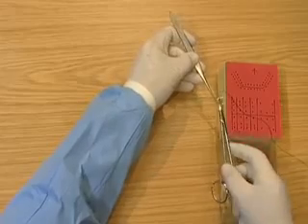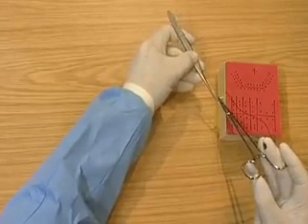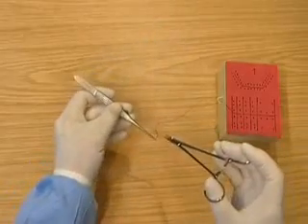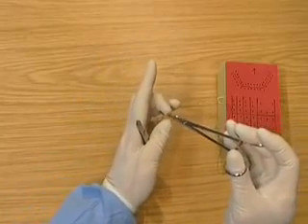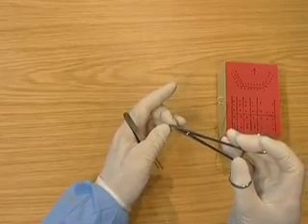Take the needle with the tissue pickups, go to reverse grip to unlock the holders, then pass the needle to the needle holders. Park the tissue pickups, holding the needle between the second finger and thumb to protect the patient and the operator from the point of the needle.